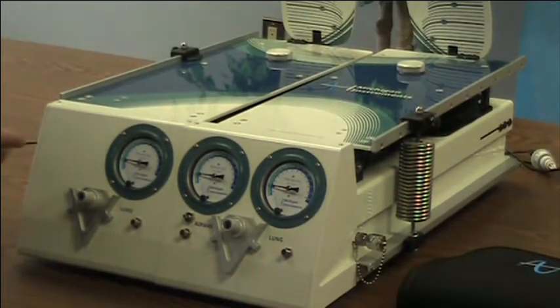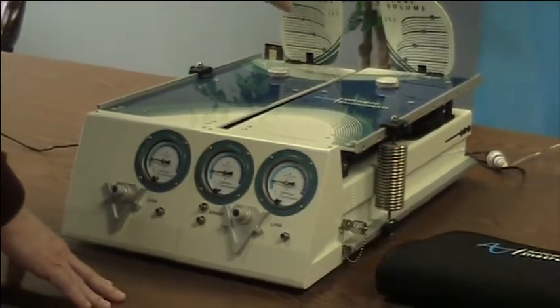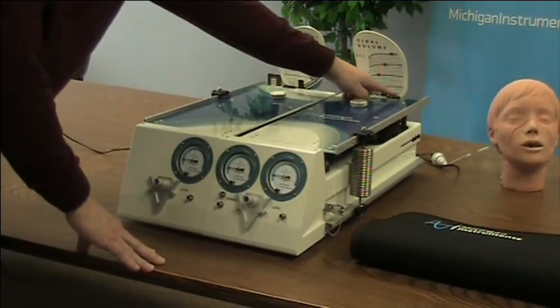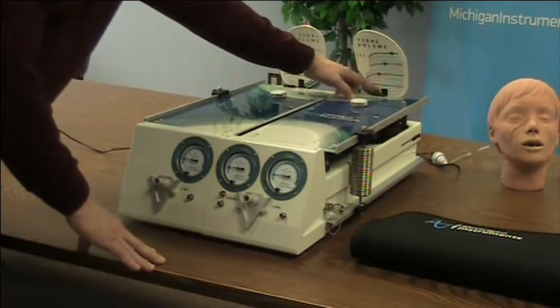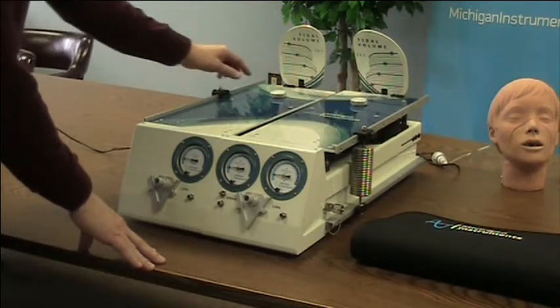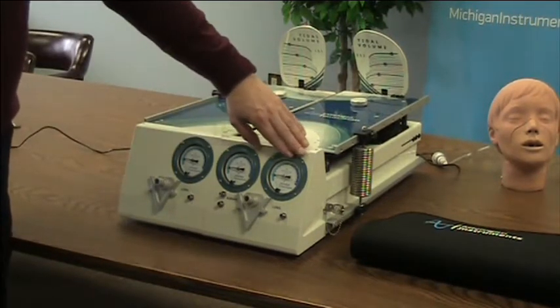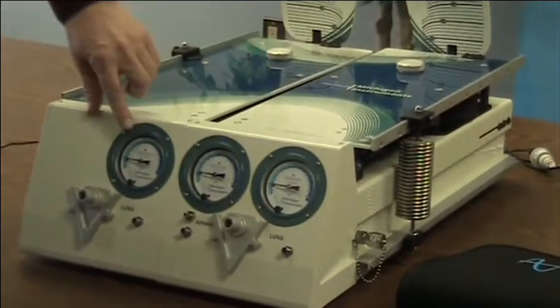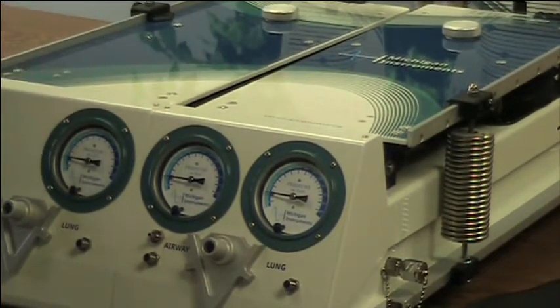The things that we monitor on the TTL are lung volume, and that's done using the volume scale on each lung. This volume scale flips up and then you adjust the pointer for that scale so that it corresponds with the setting of the compliance spring. The other thing we monitor is pressures — the pressure in the right lung, the pressure in the left lung, and the airway pressure. This way you can see the differentiation between what's happening at the airway and what's happening in the lung.